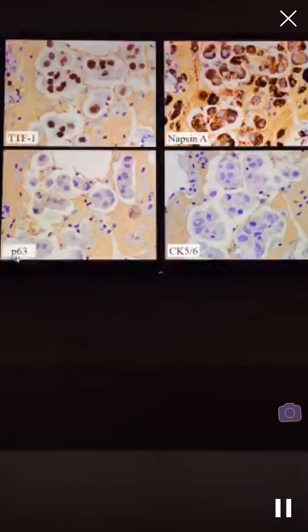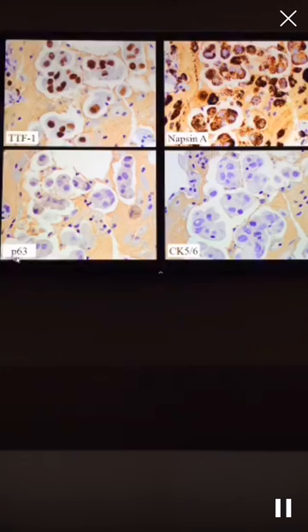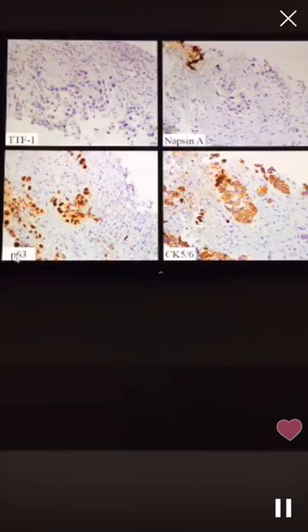It has to be. So let me make the point here. Here's a tumor that you can't really tell. You can guess, but you can't really tell whether this is adeno or squamous. So let's go to the next one. Now, if you had this kind of result, everybody would be happy with this, right? Both the glandular markers are positive, both the squamous markers are negative, so this is a poorly differentiated adenocarcinoma, open and shut. Next, please. If you had the reverse result, that would also be easy, right? TTF and Napsin negative, P63 and CK5/6 positive. So this is clearly a poorly differentiated squamous.